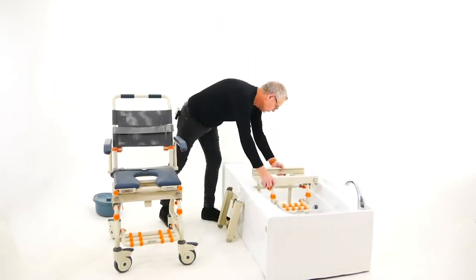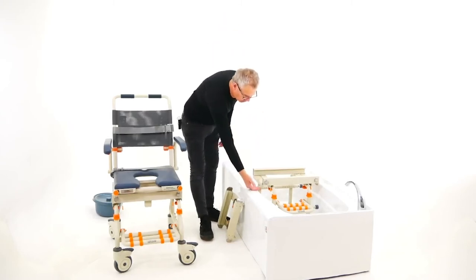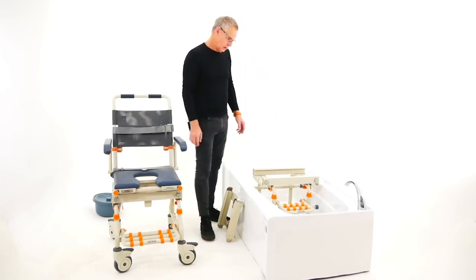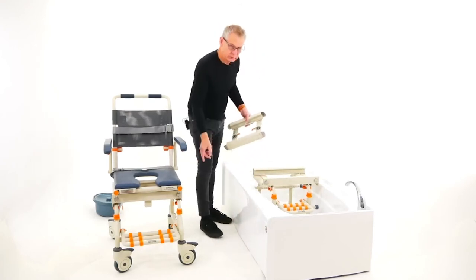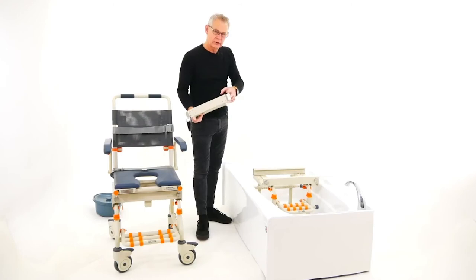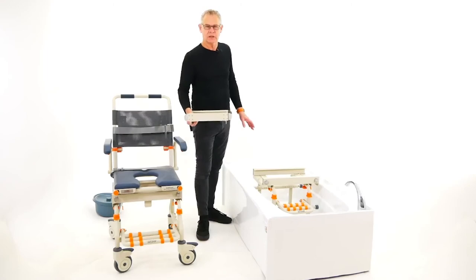The bath base unit pops into the bath and is adjustable in height so it just clears the edge of the bath. It has four side stabilizer bars, which is quite unique to Shower Buddy. Also unique to Shower Buddy is the size of the track that the wheels roll in — this track is extremely strong and sturdy, making the transfer superior to any other solution.